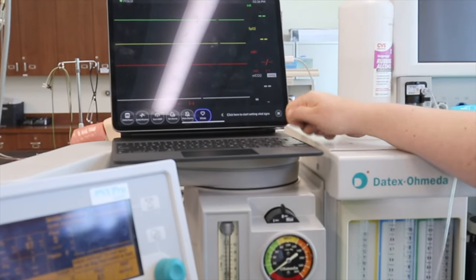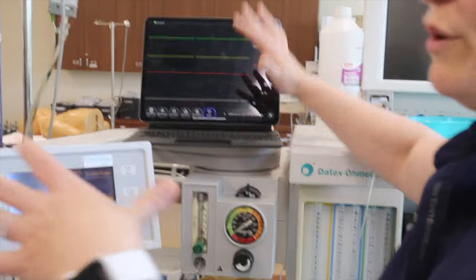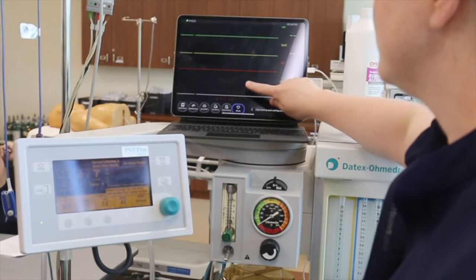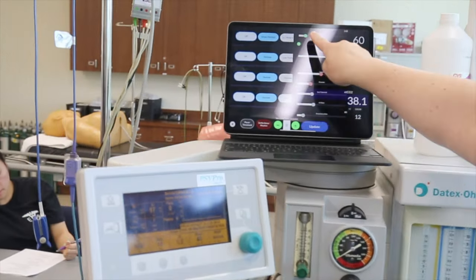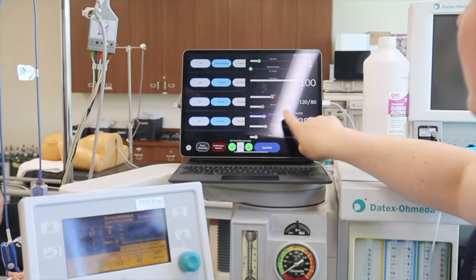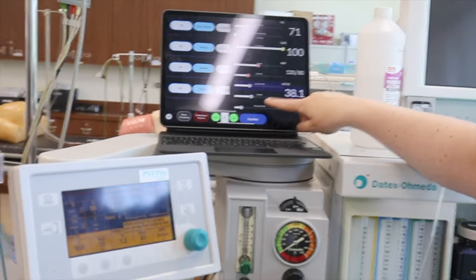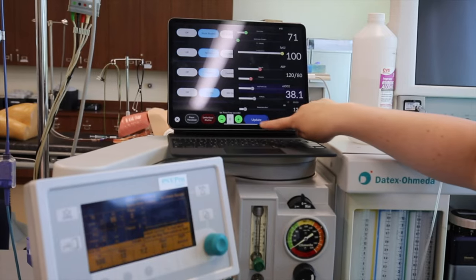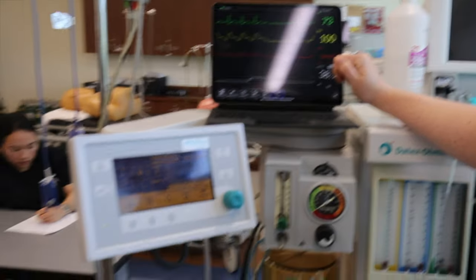recognize. And then to manipulate vital signs, and obviously the person who's performing the MS MAIDS check and induction is not going to be the one manipulating the vital signs. But you go to vitals, you turn all of these on, you can toggle parameters here, you can give yourself PVCs, manipulate the systolic and diastolic arterial pressures, I:E ratios, respiratory rate, and end-tidal CO2. So we'll just hit update there, and then you get readings.